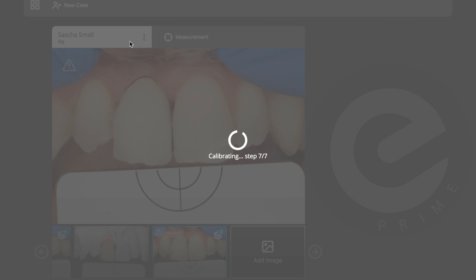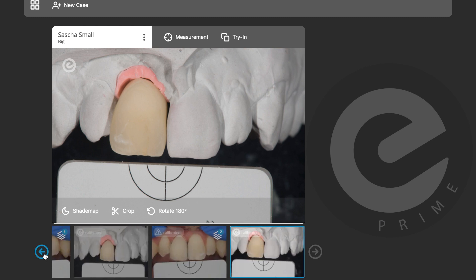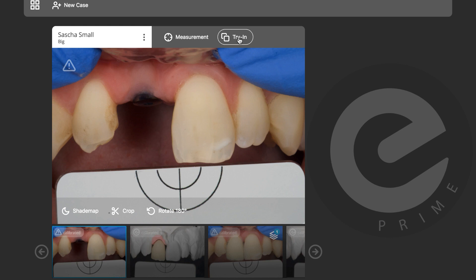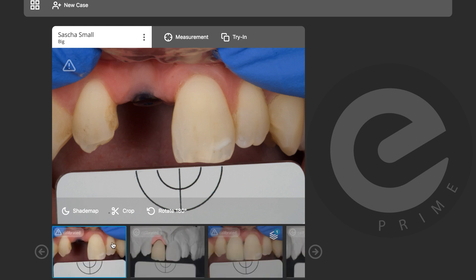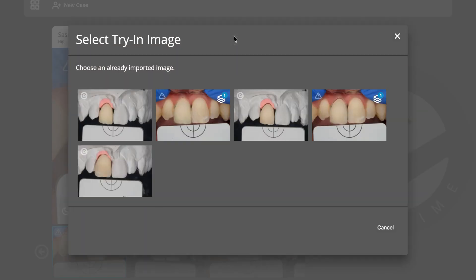This is the final moment where we see if we were successful. The crown is sitting on the model and I'll check what the delta E is. I'll go back to the original picture and do a try-in — very easy and simple — then select my last picture.